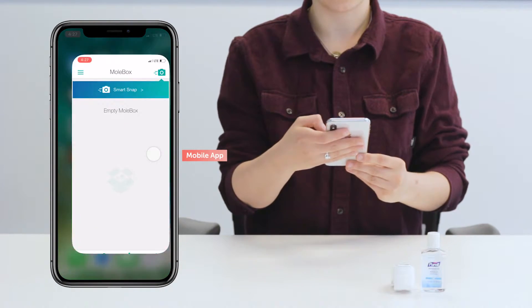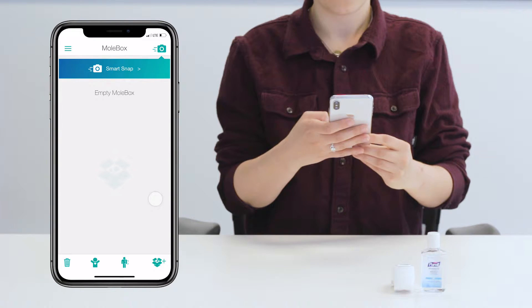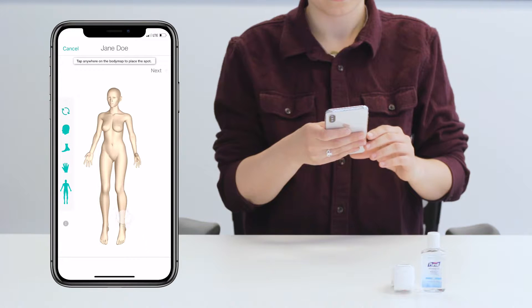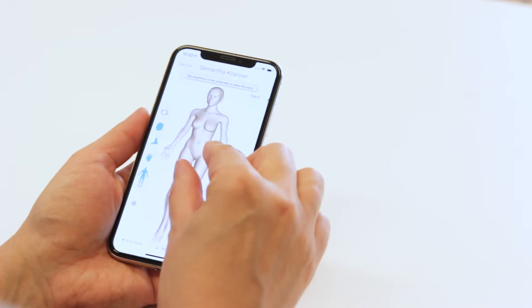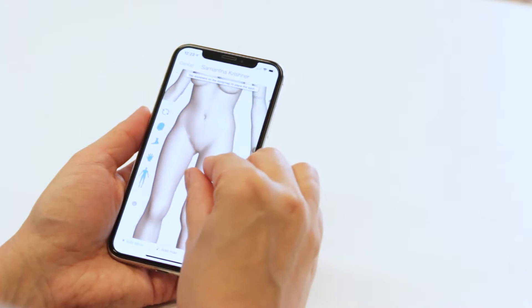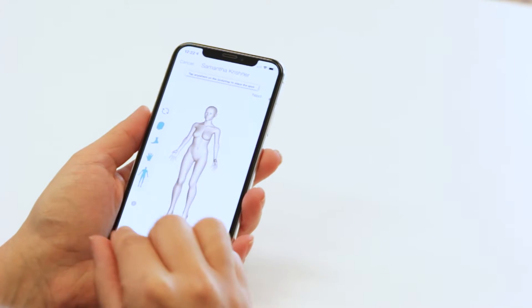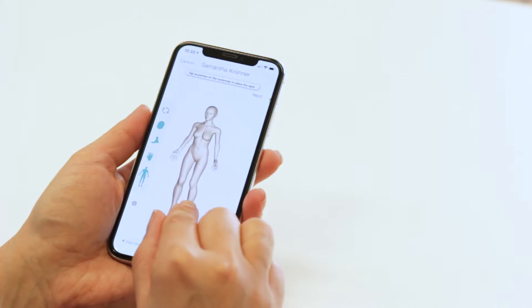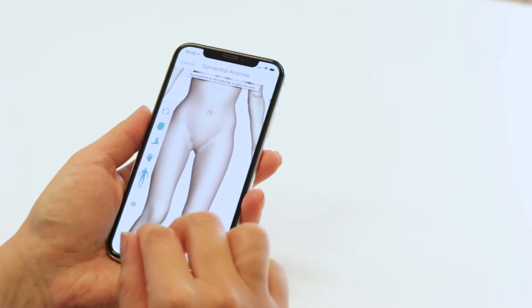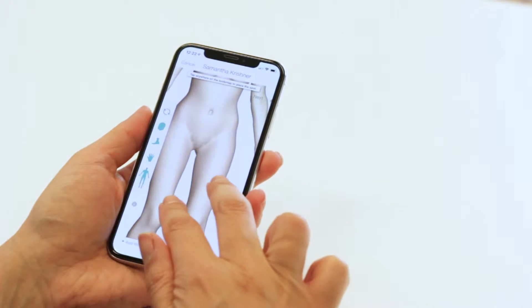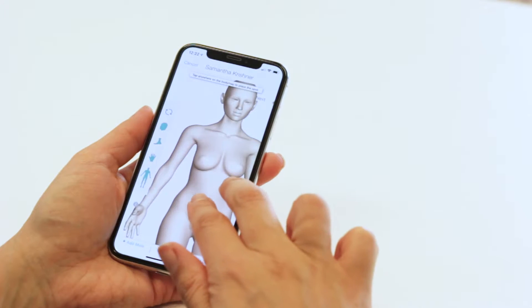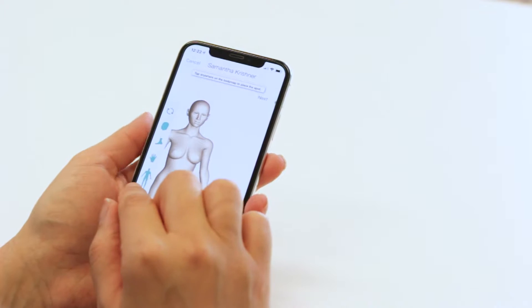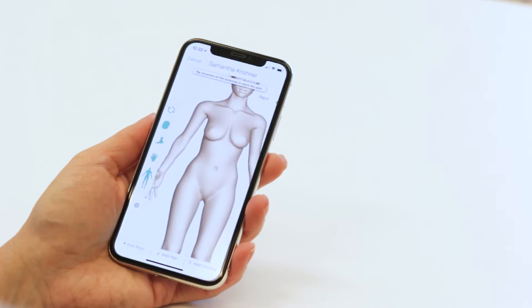Let's get started with imaging. To add a spot, press the mole box icon. You can easily navigate the 3D body map with just a few taps. To zoom in and out on the map, use two fingers to pinch the screen. To rotate the view, tap and drag the body map with one finger. Finally, you can pan around the screen by tapping and dragging with two fingers. Tap a body part icon to automatically focus on that area to make the spot easier to place.